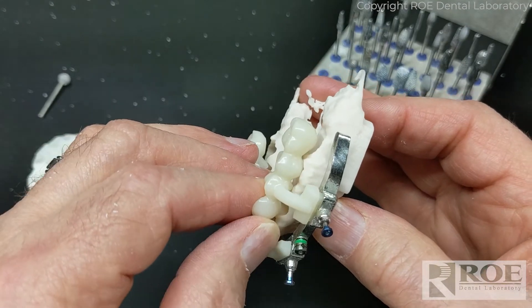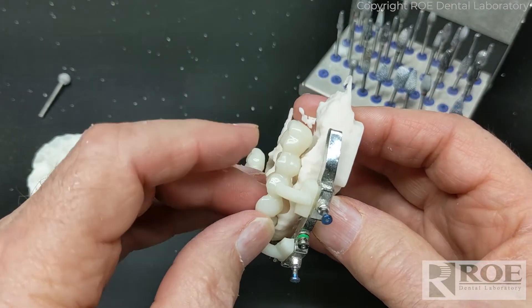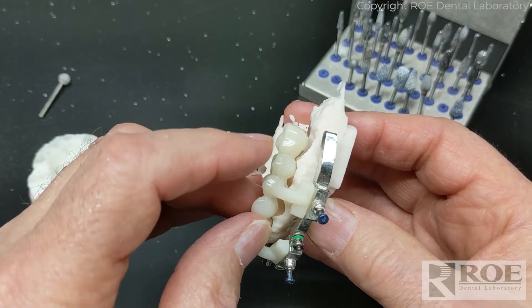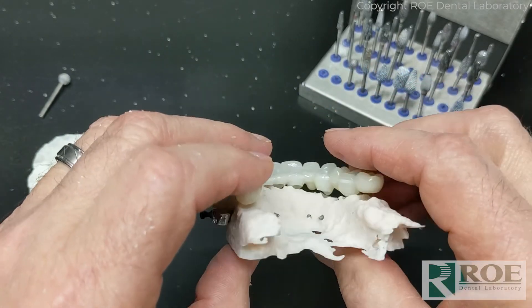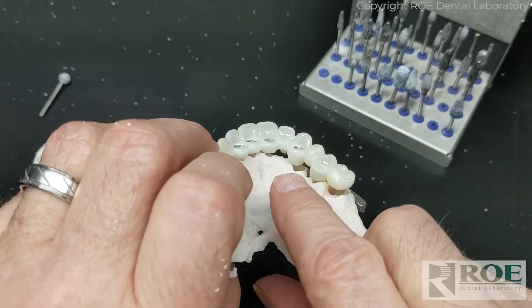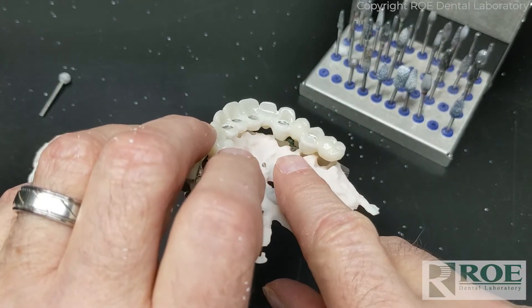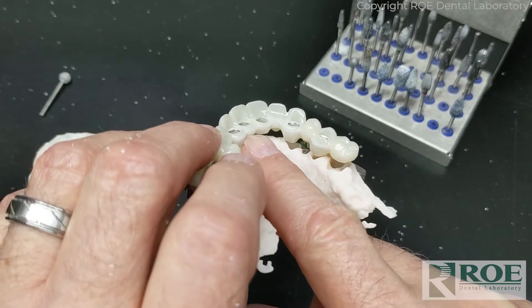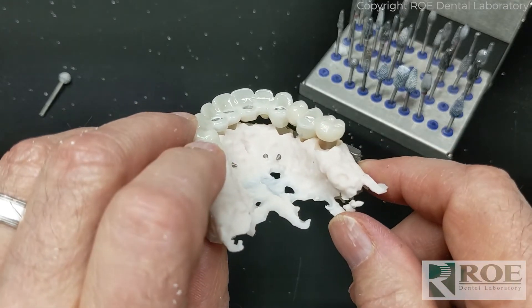The pontic section on the bridge is not the culprit holding this from seating — it's the tooth in front of it, the premolar. The prosthesis itself hits the bone before it seats, and also on the lingual side we have some interference on the lingual of the sockets. We're going to address some of those areas on the prosthetic first to see if that solves the problem. It usually won't, but it'll at least allow us not to have to reduce as much bone.